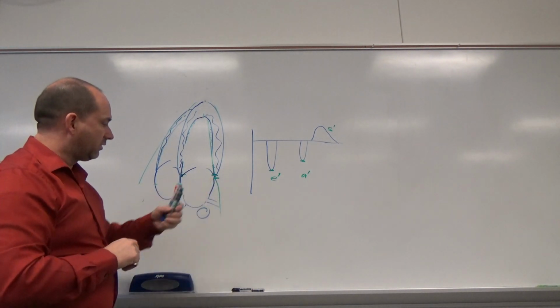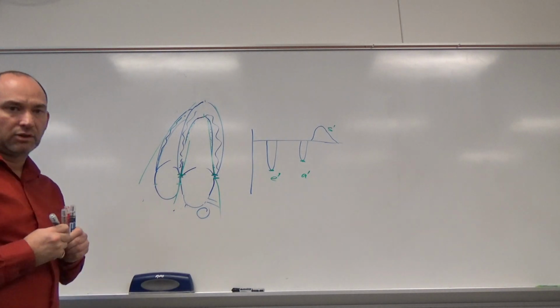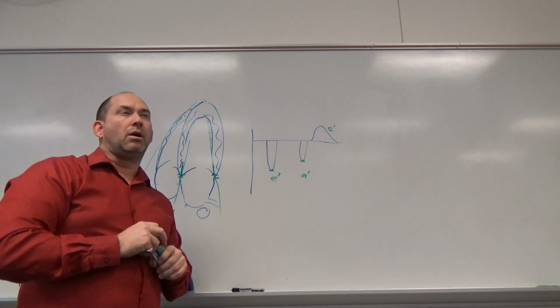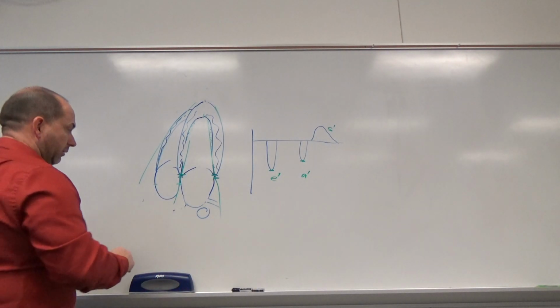You're going to do that on this annulus, and that's the lateral wall, and then you're also going to do that on the septal annulus as well. So they should be similar. This one's going to be a little bit bigger, but we're talking about velocities around 8 to about 20 centimeters per second. So it's very slow compared to the flow that we're used to looking at.